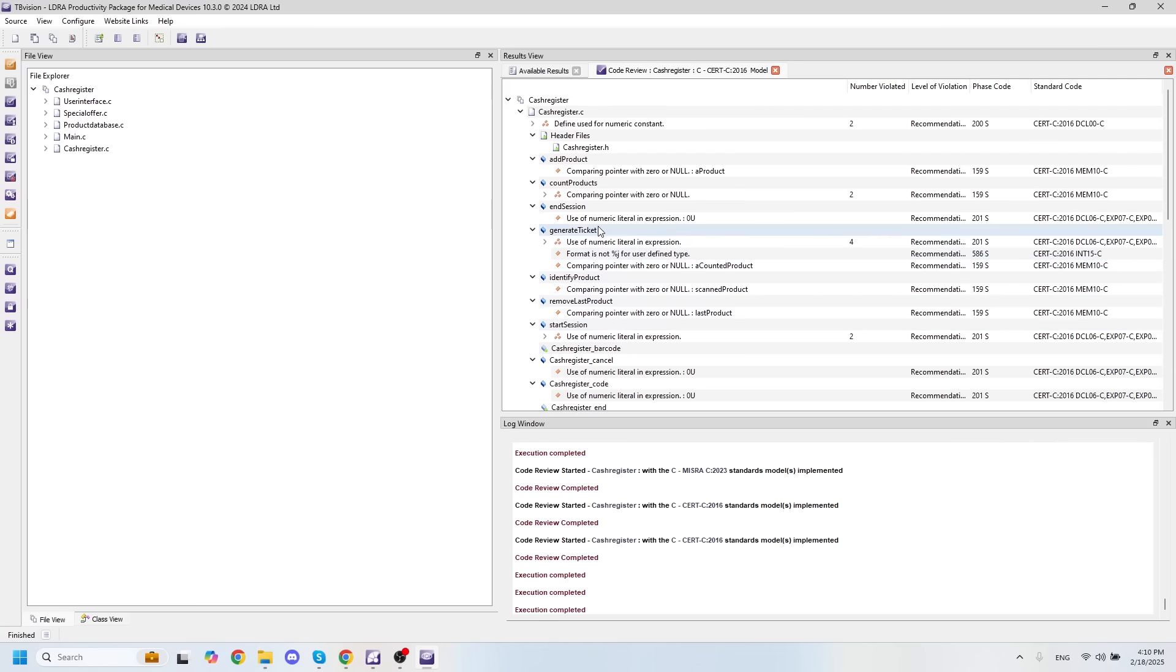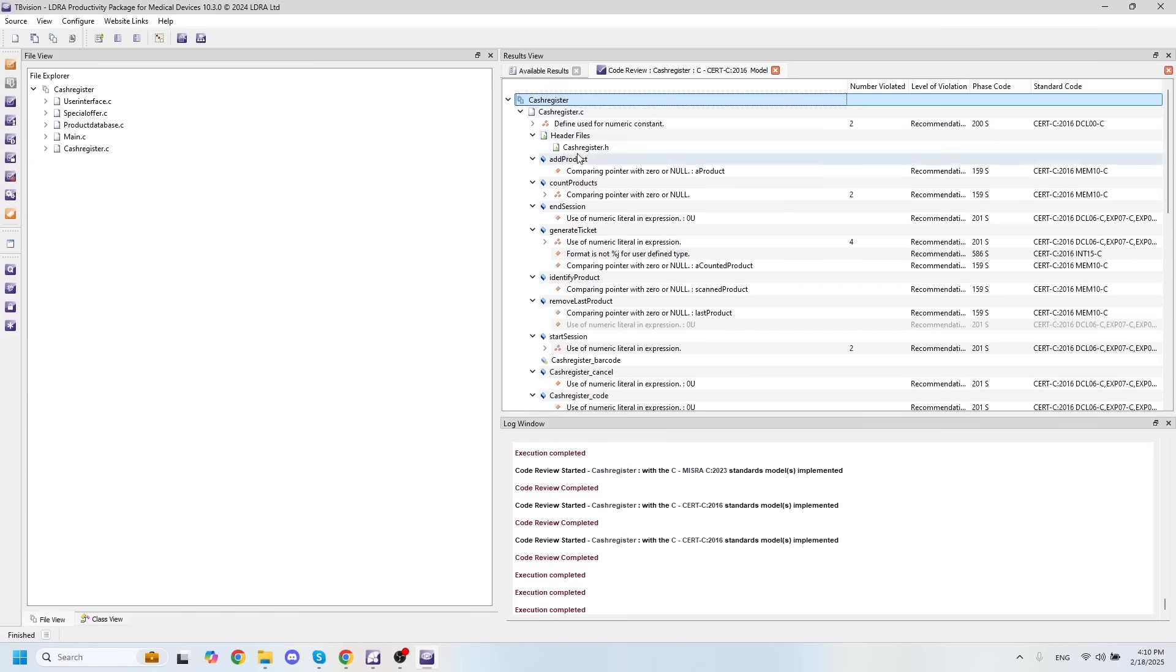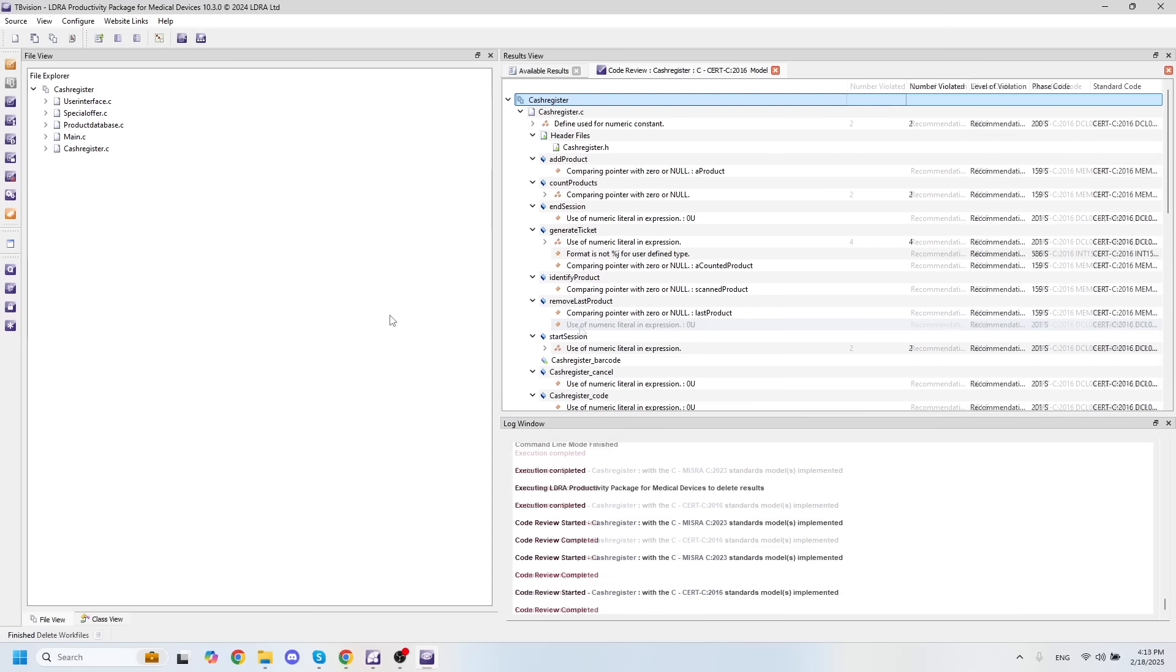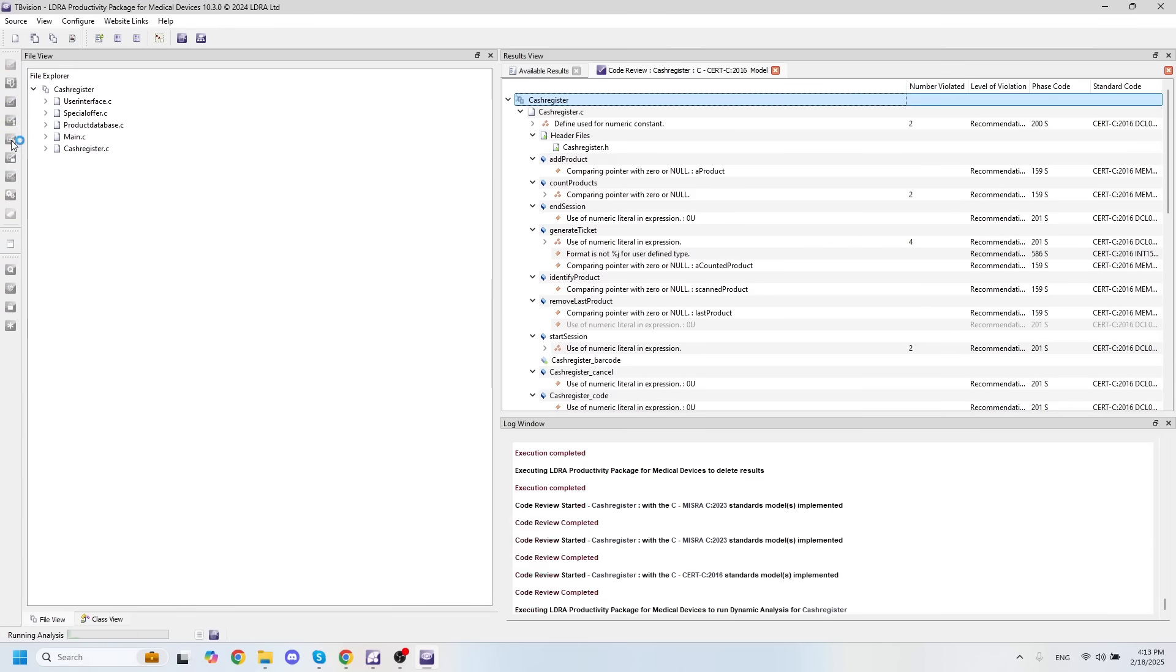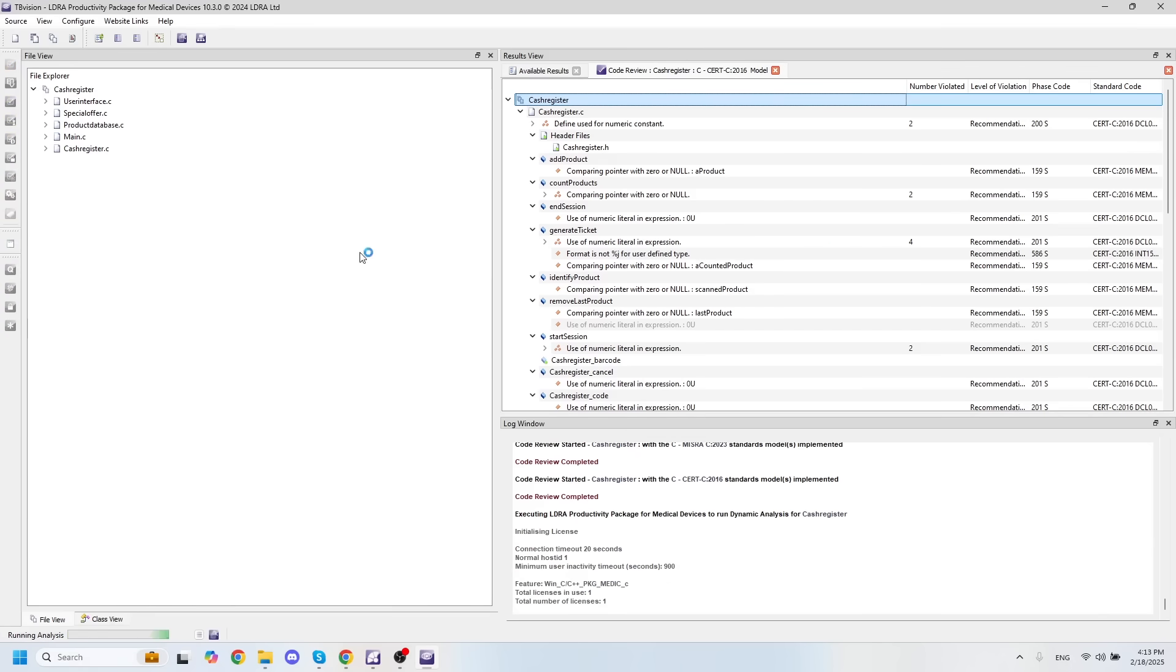And now we can see that that violation has disappeared from our code review. If I want to get it back, I'll simply right click and hit show violation excluded, and we can see that it's now here. It's just grayed out. The next thing you'll likely want to do is run some dynamic analysis, let's say on the host machine. To do that, I can simply run dynamic analysis by clicking this button right here.